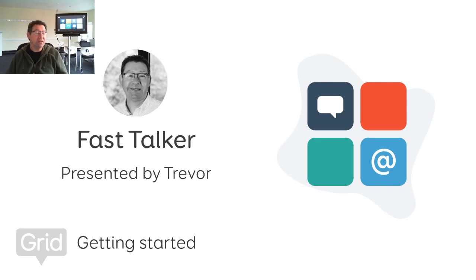I work on the content team at Smartbox, which means I'm privileged to be able to work on designing some of the grid sets within the grid software.